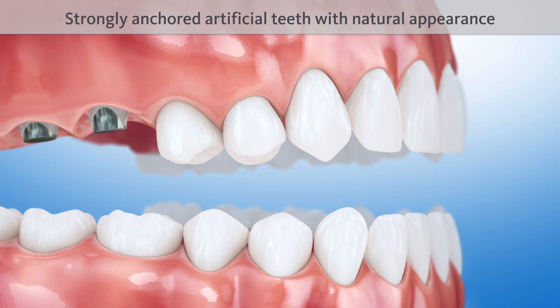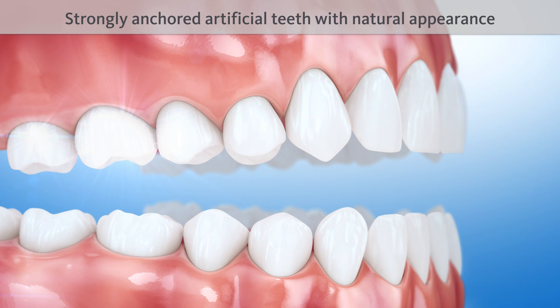Due to the sinus floor elevation, the implants and crowns fulfill the function of strongly anchored artificial teeth with a natural appearance.